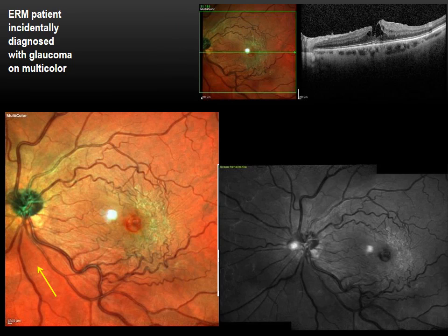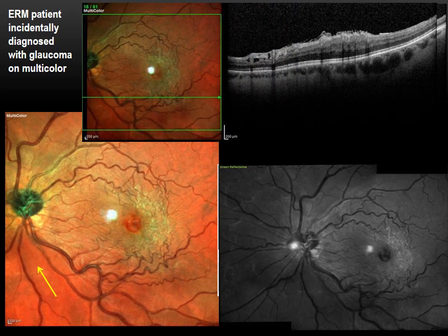This is another epiretinal membrane patient, again incidentally diagnosed with glaucoma on multicolor. This patient with an epiretinal membrane and a lamellar hole was being evaluated by a retina specialist when they noticed that the reflectance of the nerve fiber layer superiorly was different than the reflectance inferiorly. One can see this dark band inferiorly showing loss of nerve fiber layer thickness despite the absence of cupping in the optic nerve. A cross-section through that area reveals losses of the nerve fiber layer and ganglion cells in the region below the surface — losses we would not have known to look for had we not seen the multicolor image.